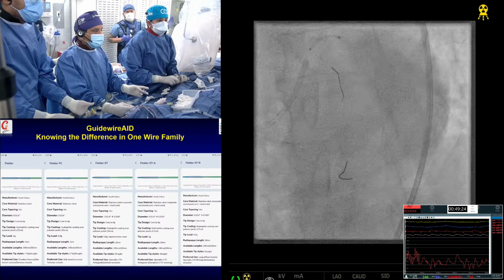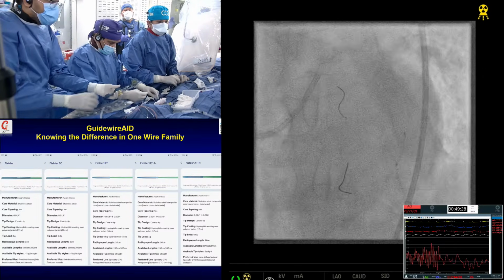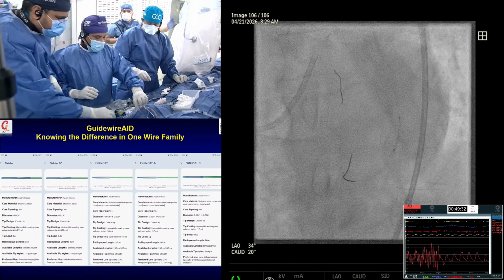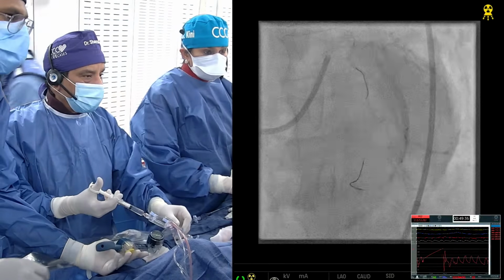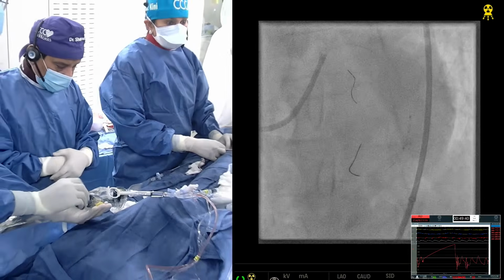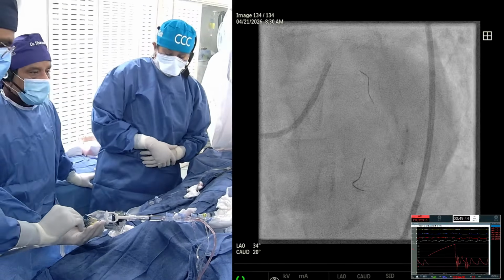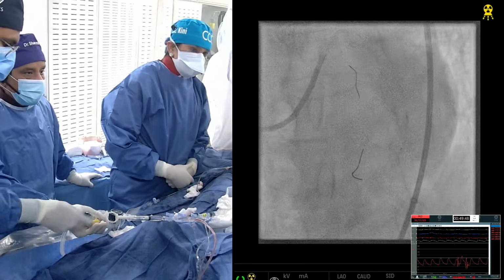Okay. Excellent. No surprise, there was some challenge there. I didn't want to dilate because we want to IVUS and prove that. Okay, get the IVUS ready. We have the IVUS ready, we're fully ready. Okay, 12, good. 14. Okay, down. Go up again.